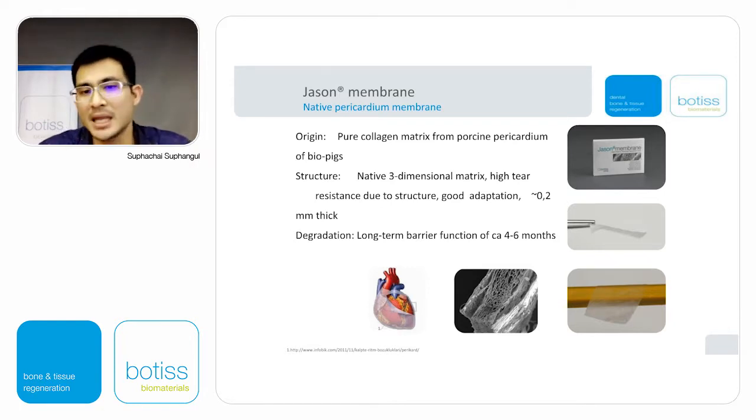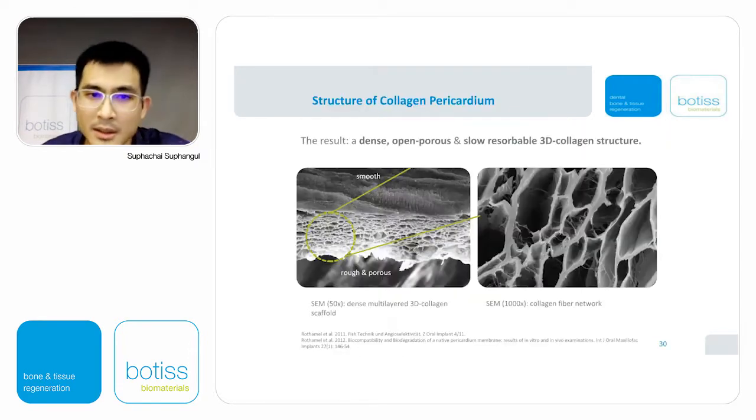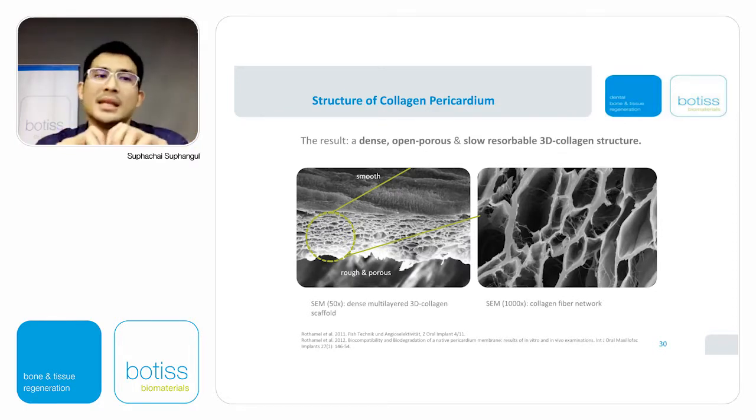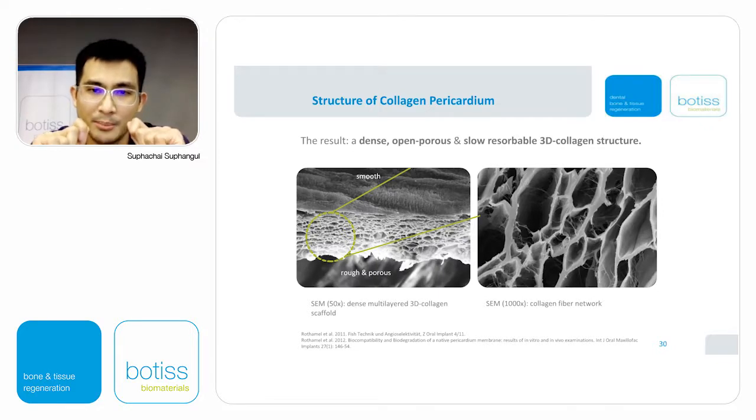Myself, I use that for big GBR, or in some areas where we need long-term regeneration. You can see by electron microscope, the structure is very dense. That's why even though it's very thin, the barrier function is very good.